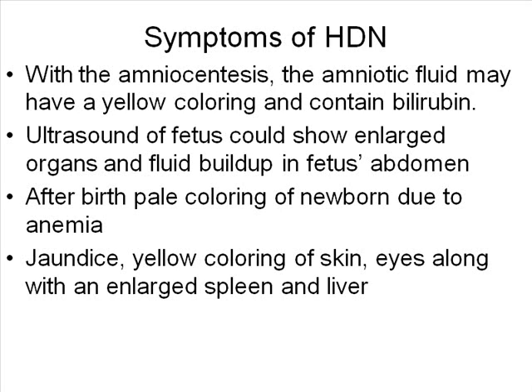So if you have an A baby that has anti-A,B on its red cells, what are you going to transfuse this baby with? O, okay? Because the mom's O, you're going to give that to the baby. We used to actually take the mom and cross-match the mother to the unit and then give the baby that unit of blood. Now, in that particular instance, you do need whole blood. The unit should be less than 5 days old. You want fresh blood.